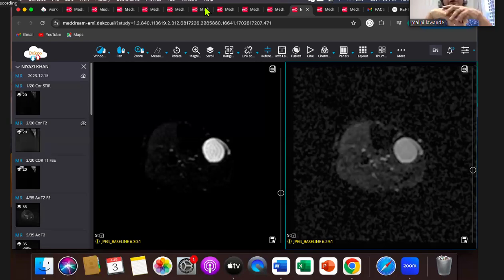One, where the diagnosis can be made for sure, like say myxoma, hemangioma, lipoma, myositis ossificans, elastofibroma, these where for sure you can make a diagnosis on MR. The rest of the lesions fall into an indeterminate category, or it's a soft tissue sarcoma, which is clearly very heterogeneous, aggressive, that's fine. But otherwise, a lesion is indeterminate, and it's fine to not give a diagnosis on MR.